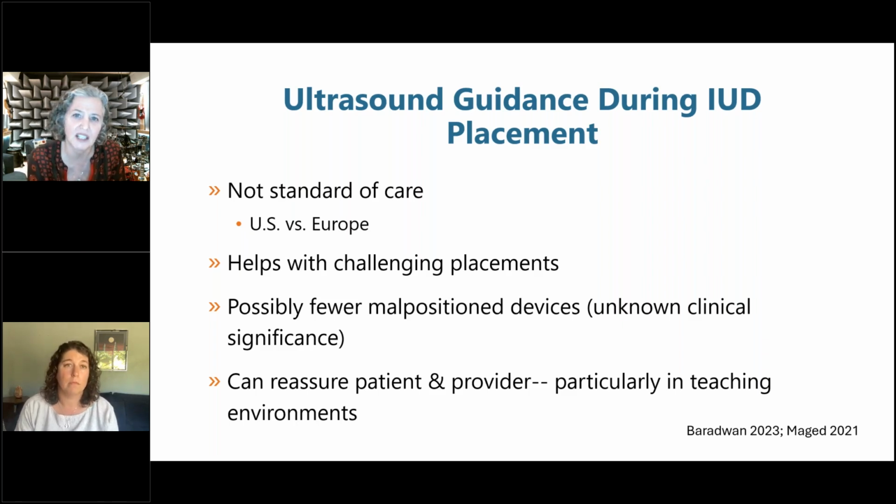So if you do have an ultrasound and you know how to use it, and you have somebody in your practice who can be on the ultrasound while you're doing the placement, then it's a wonderful thing to do. It's also really helpful to look afterwards and make sure that the IUD looks like it's where you want it to be, which is also lovely for the patient to see that the IUD is sitting in their uterus. How reassuring is that? Definitely, however, it's not standard of care, but it's definitely helpful with a challenging placement.